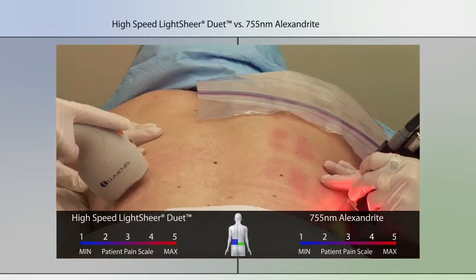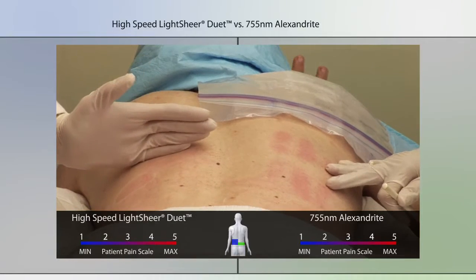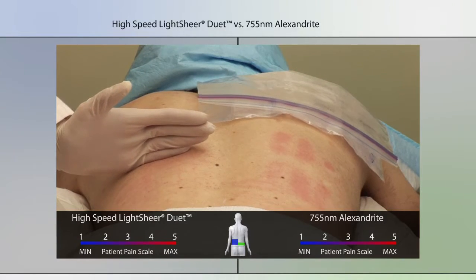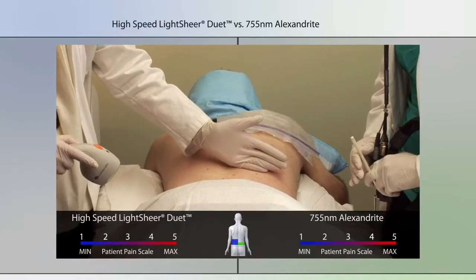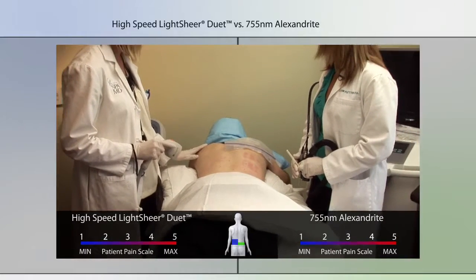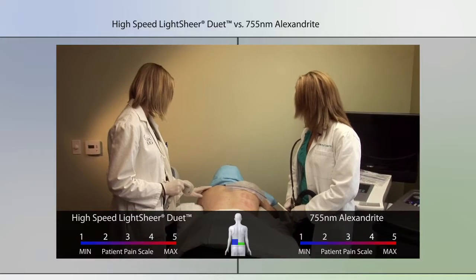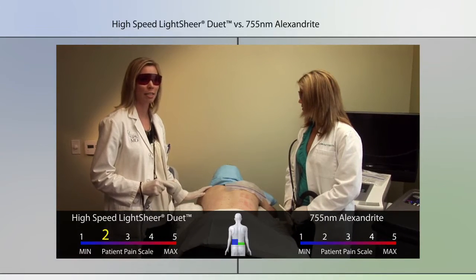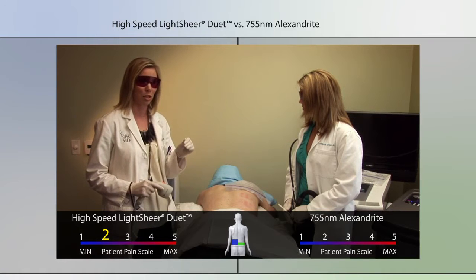Yeah, so we'll take a moment to stop here just a second. You notice I've almost gotten done with about this much of the back, about halfway up the back, and Laysan, you got up about here, is that right? That's right. We'll ask the patient on your left side, which was treated with the LightSheer Duet, about how uncomfortable it was, and he's indicating a 2 on a scale of 5, with 1 being very minimal pain and 5 being the most extreme pain.